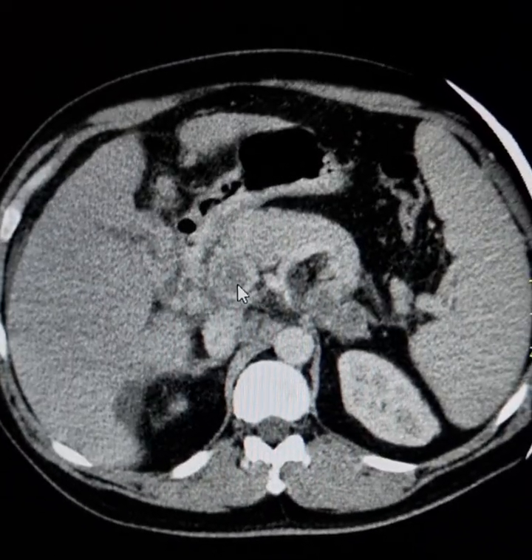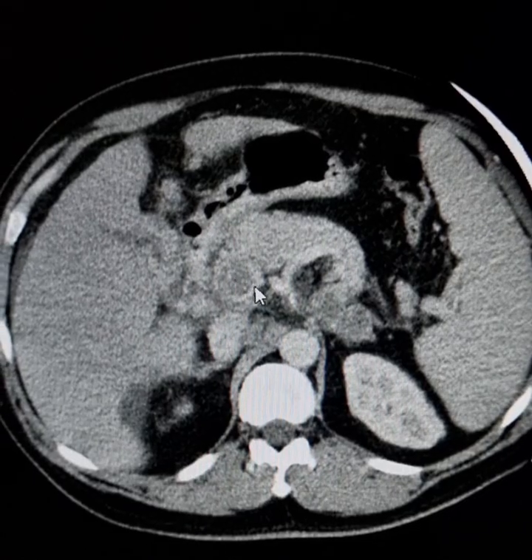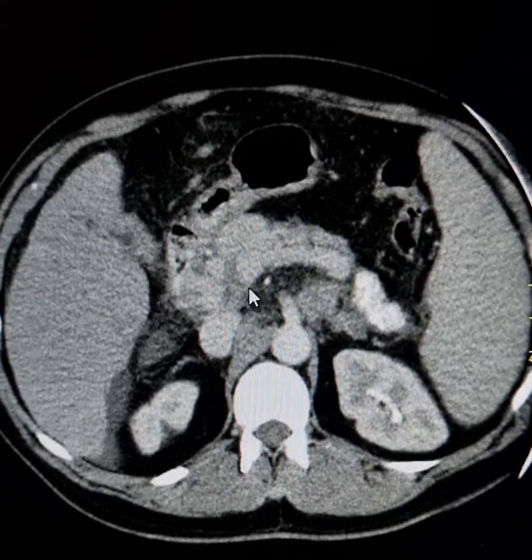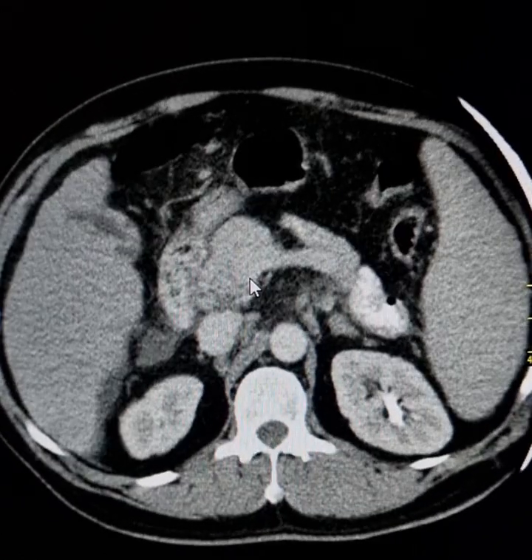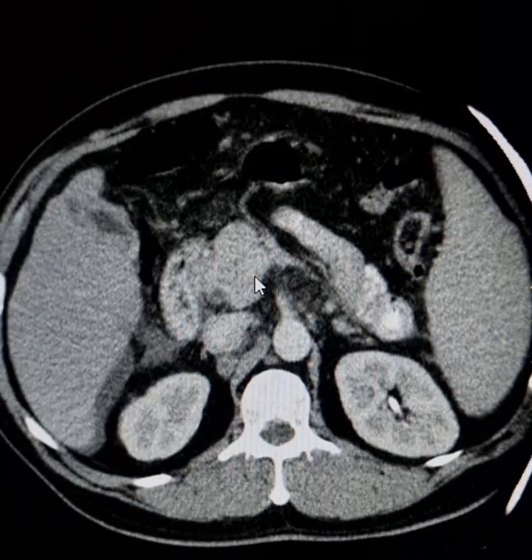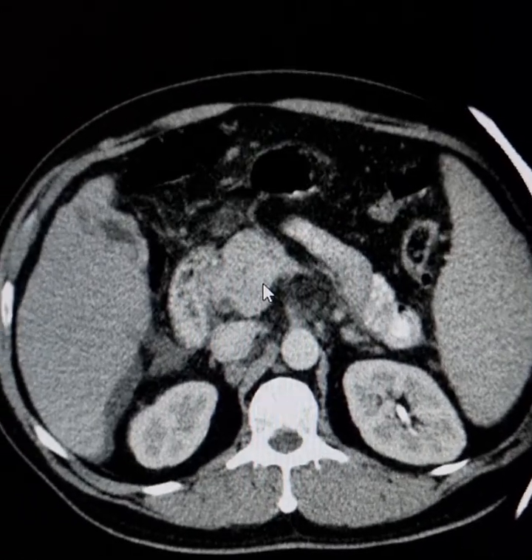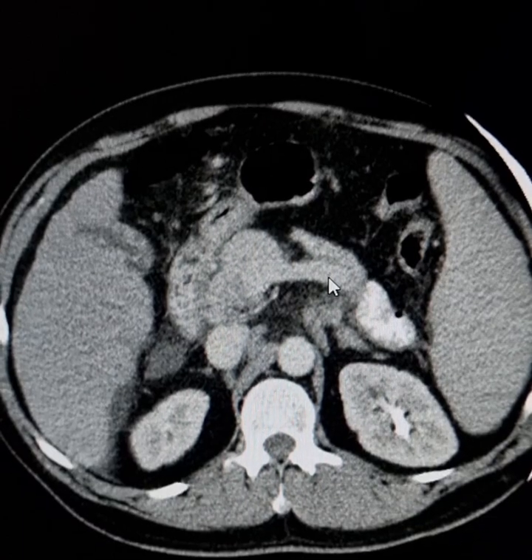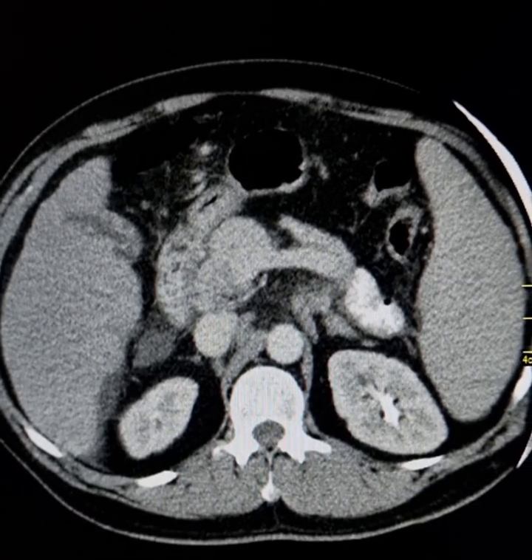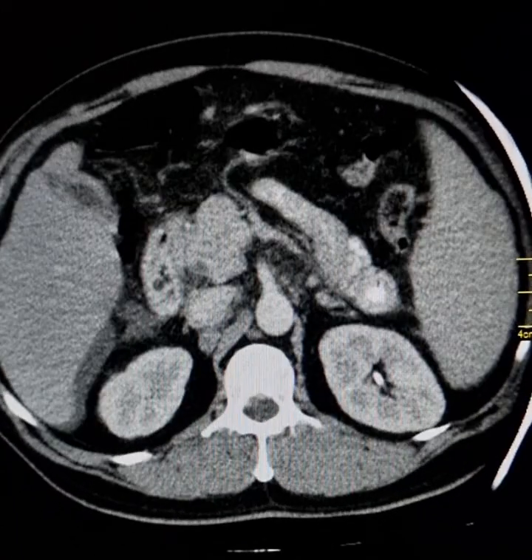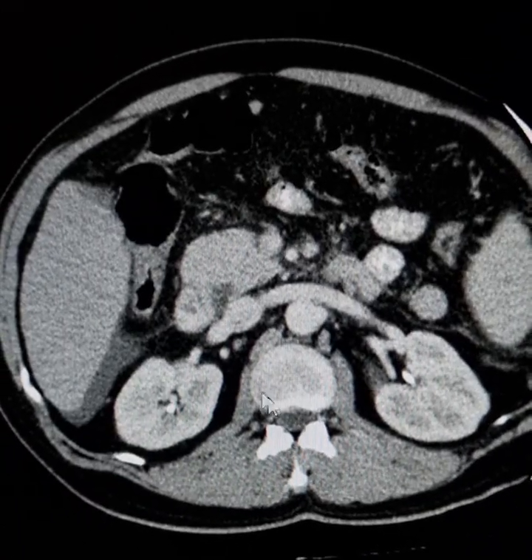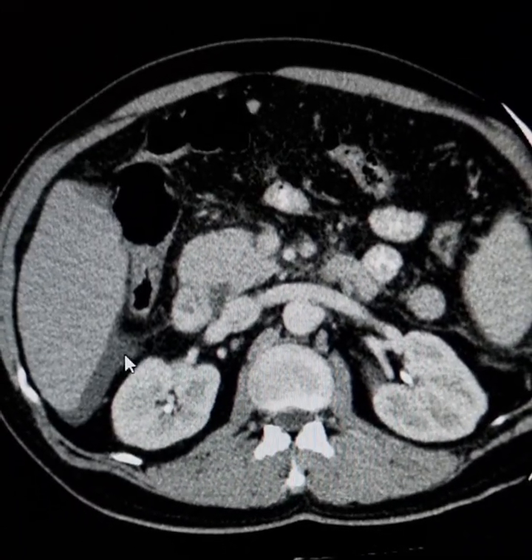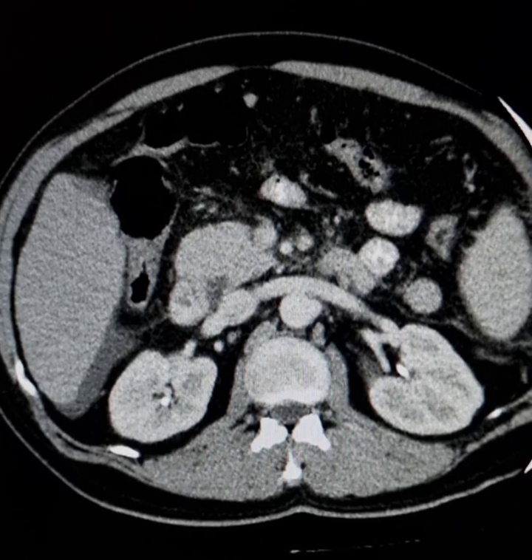This is the thrombus in the portal vein. Tracing it down, the superior mesenteric vein is clear of thrombus. This is the splenic vein, which is also clear of thrombus. There is ascitic fluid here.